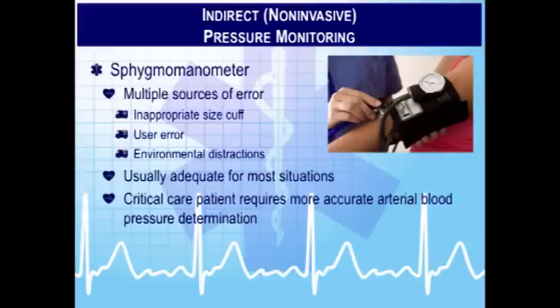What you should know about that is if it's just displaying a mean arterial pressure, you can usually believe that mean arterial pressure. What is a normal mean arterial pressure? What do we want someone's mean arterial pressure to be? So you get the systolic, you get the diastolic, and you get the mean on those devices. Anything above 65 is what's acceptable. So 65 to 85 is what a mean arterial pressure is going to typically be.